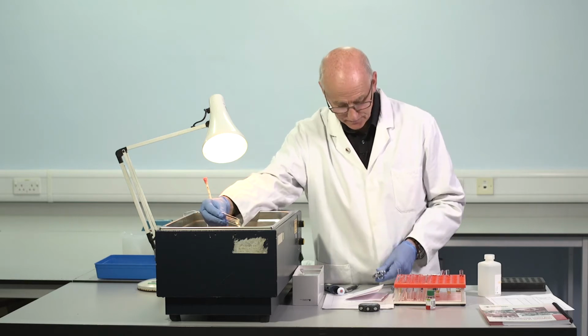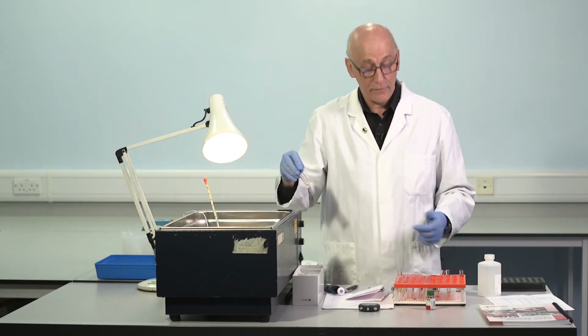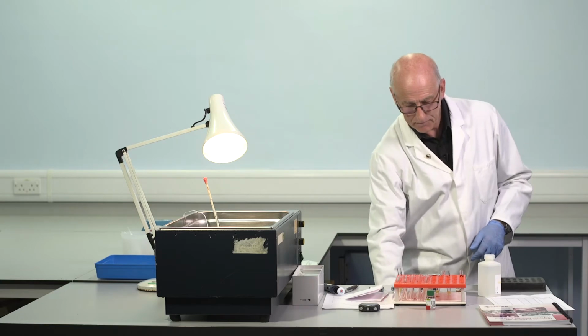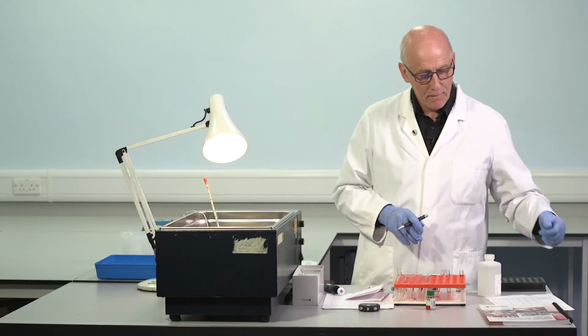And it's now clotted. So we've got 3 different concentrations, 3 different clotting times. 63 seconds, 69 seconds, 85 seconds. Progressively longer clotting times. Why longer? Because the factor VIII is more diluted, lower concentration, so there's less and less factor VIII, therefore there are longer clotting times in each of the mixtures.